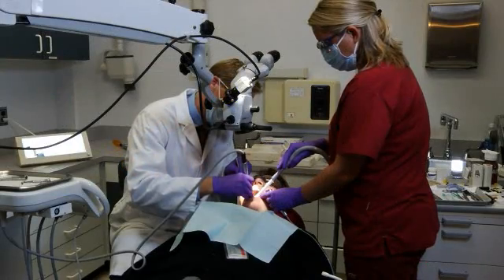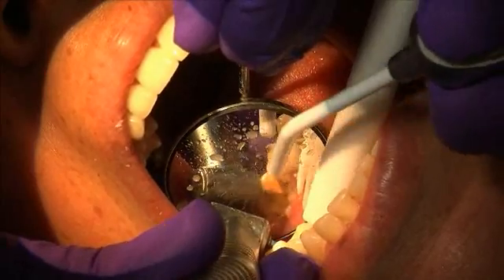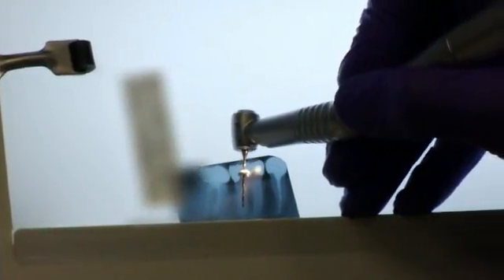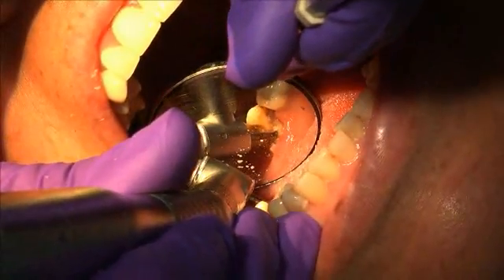Select the universal drill to remove root filling. Leave a minimum of 4 mm of filling apically. Select the post size and matching drill. Use the appropriate drill to widen and shape the root canal.